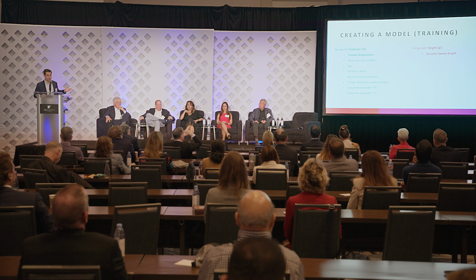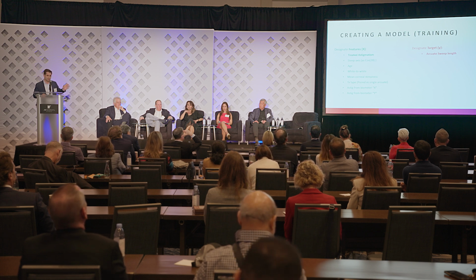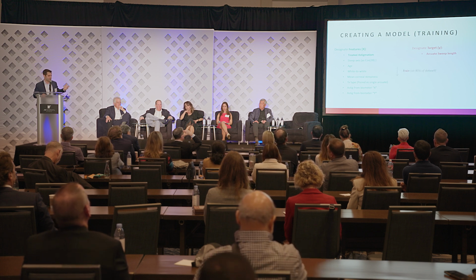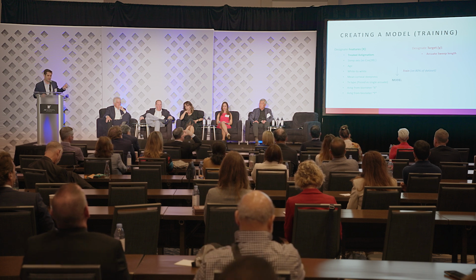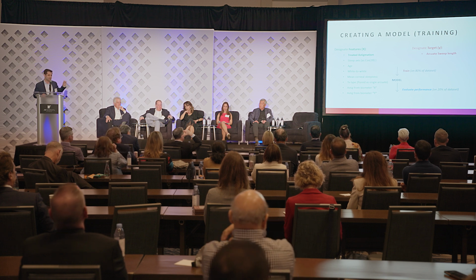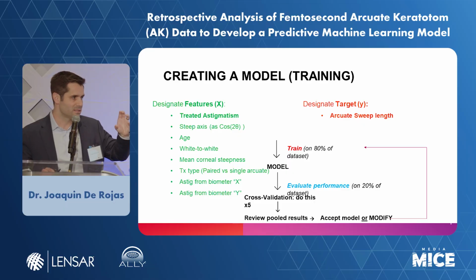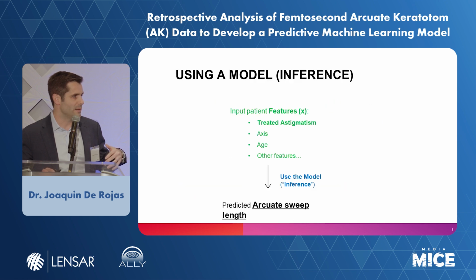And this is what machine learning, or AI, is. The green stuff are factors, things that we think may contribute. The red is our final outcome. Basically, you take 80% of the data set and train it to see if it can find the complex interplay of these factors. Then you test it. Once you have a trained model with the weights, you test it on the remaining 20% of the data. You repeat that with different subsegments to get an average over 5. That's called cross-validation. Then you either accept it or start over. And when you hear the term inference, that just means you're using the model. You're not training it anymore. You're just going to use it, plug and play.